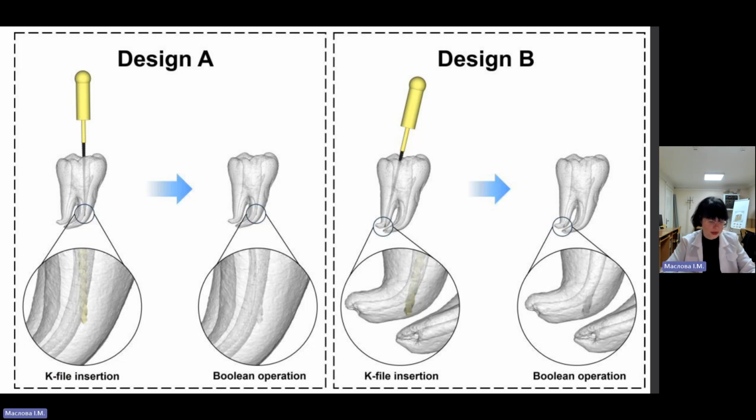Also, tissue may be left behind in the coronal pulp, especially in the pulp horns, leading to discoloration of the tooth. On the other hand, tooth structure should not be removed indiscriminately, as that would lead to an unnecessary weakening of the tooth and would complicate the restorative procedures. The access cavity should expose the entire pulp chamber, including the pulp horns. In addition, cusps may have to be reduced to provide proper access to certain canals or to prevent uncontrolled fractures if they are weak.